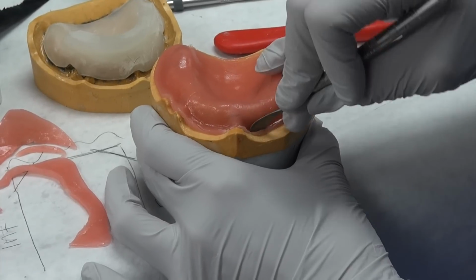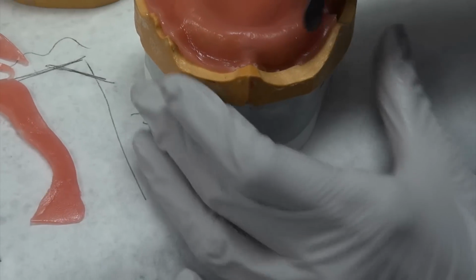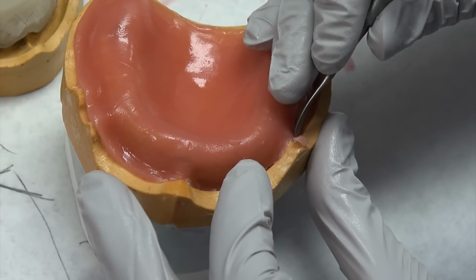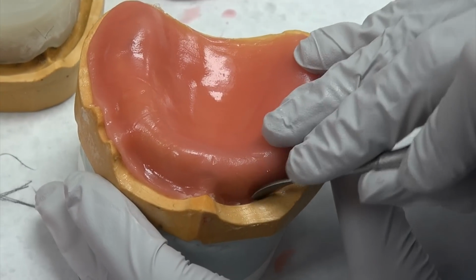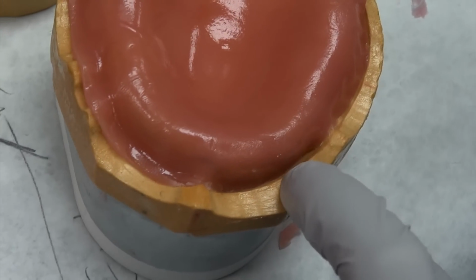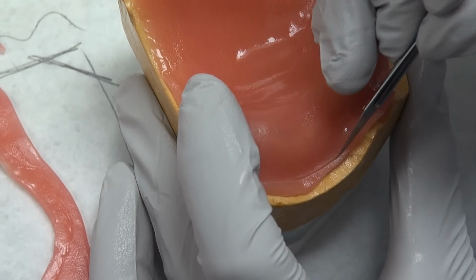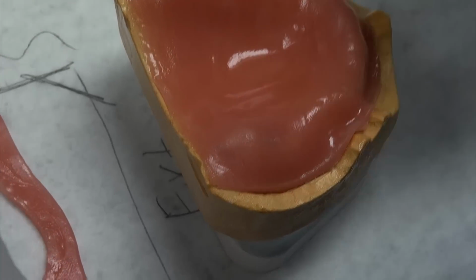Okay, so trying to go from the top downwards. So see how it kind of folds up. Okay, so that's a good example of when you have too much. So you can also use this little instrument to take away any excess. Okay, but you see how it gives it a less smooth cut. So again, you see how it goes all the way to the depth of the vestibule, but it's still not filling it in, right? And come by, get it just a little bit of a closer cut. See how it just peels away.